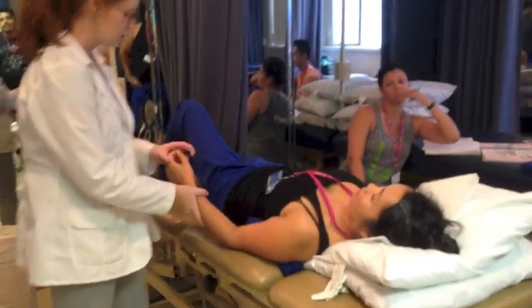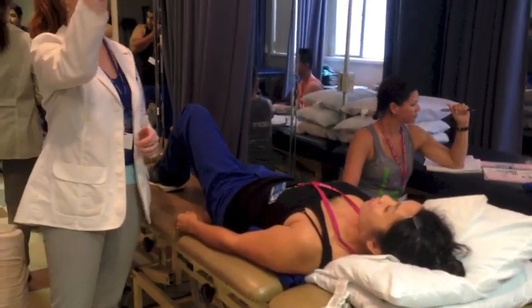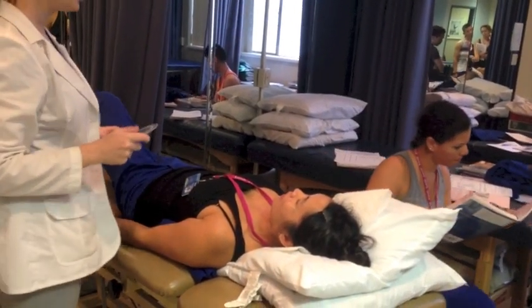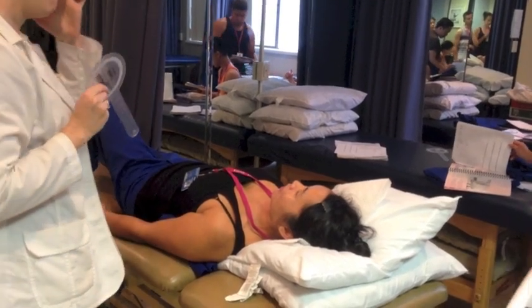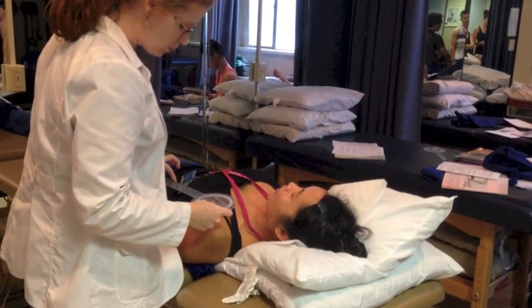I'm going to use my goniometer first, but before that, let's set up our zero. Can someone tell me where our fulcrum is going to be? The anterior aspect of the acromial process.